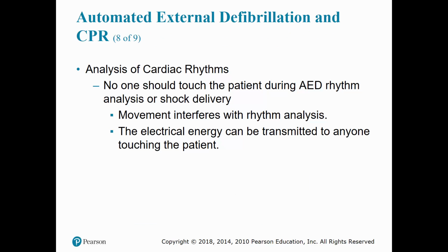All right, analysis of cardiac rhythms. No one should touch a patient during AED rhythm analysis or shock delivery. Movement interferes with the rhythm analysis. The electrical energy can be transferred to anyone touching the patient. So make sure your partners are clear, because we don't want to have 2 patients instead of 1 patient.